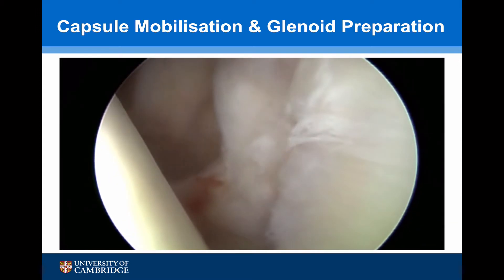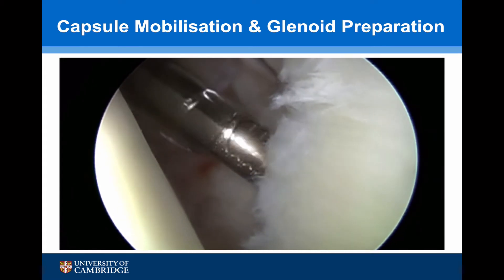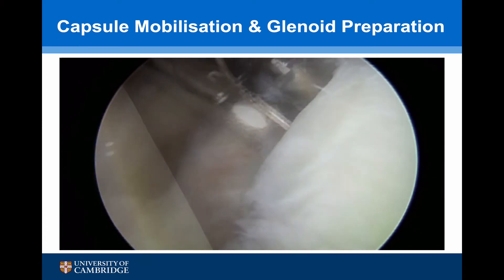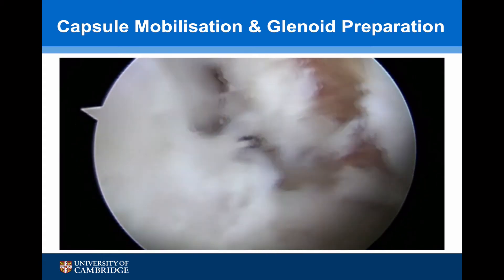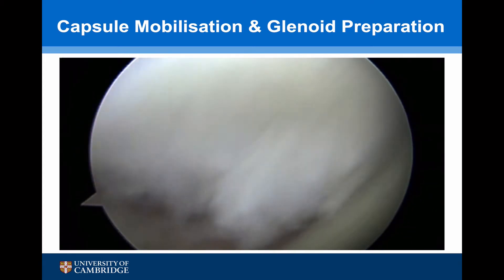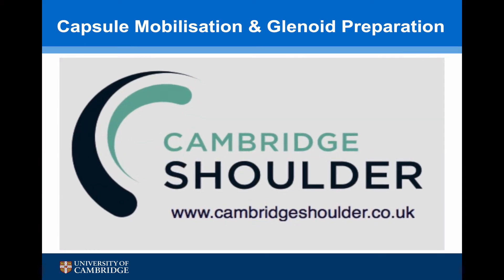Having mobilised the capsule, we're now going to prepare the glenoid. A shaver removes any residual soft tissue, and this is the hooded burr decorticating the bone. Looking at the anterior portal, we can see there's a nice cancellous strip present with minimal loss of articular cartilage.